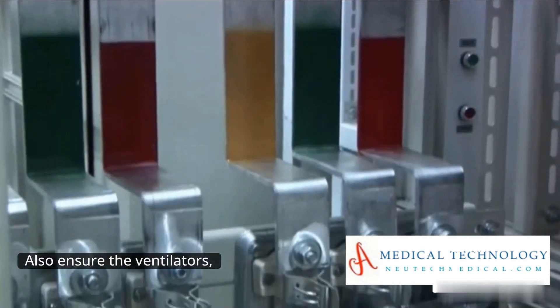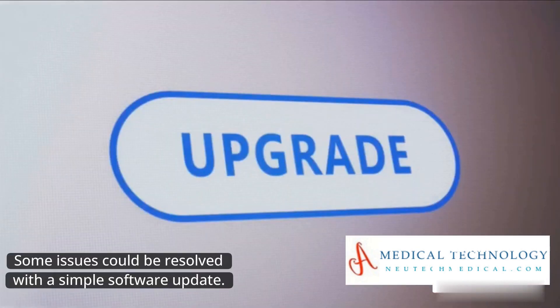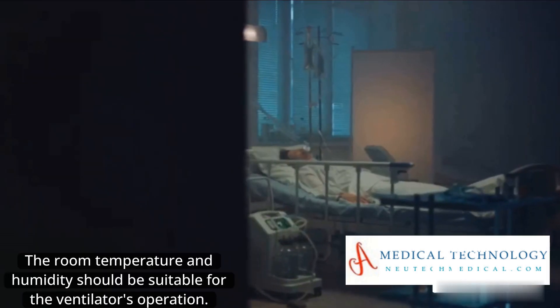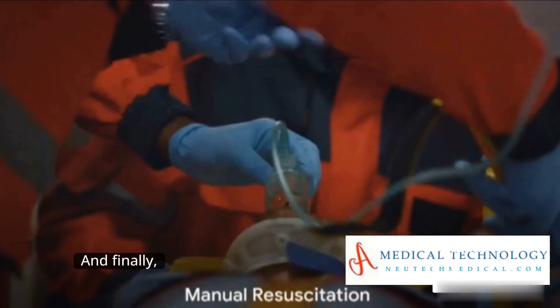Also, ensure the ventilator's software or firmware is up to date. Some issues could be resolved with a simple software update. Consider the patient's environment as well — the room temperature and humidity should be suitable for the ventilator's operation.